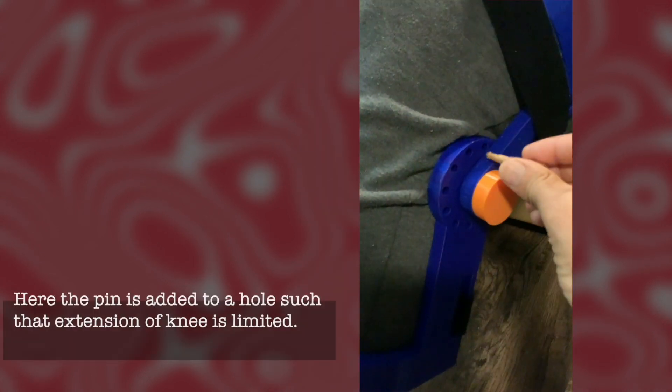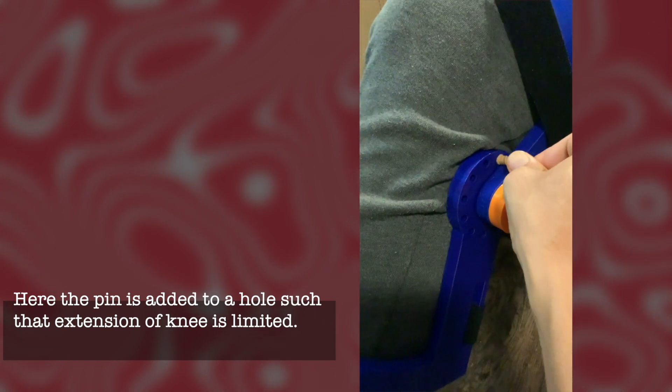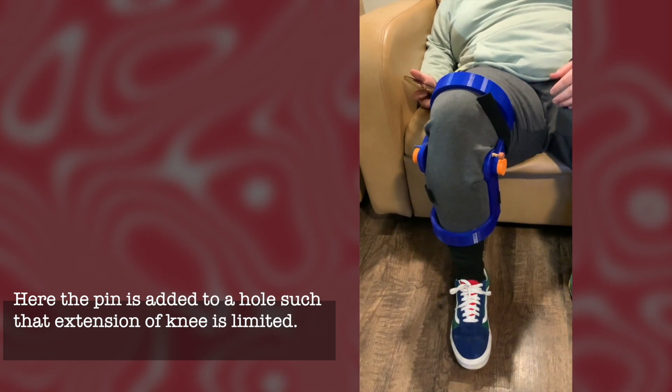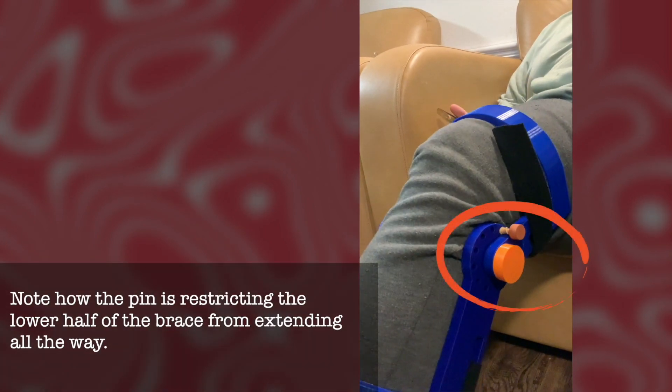Now in this setup, I've added the pin in such a way that the extension of the knee is limited. You can see that the pin is blocking the lower half of the brace from going all the way up and limiting the extension. So depending on which phase the patient is in recovery, they can adjust the angles accordingly.